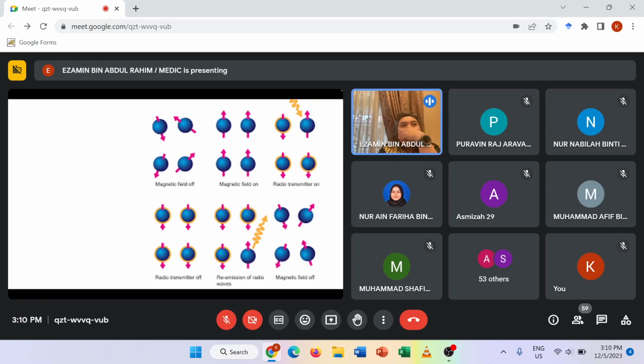The RF, if you notice, in the MRI you hear a "tet" sound. Have you been to our radiology department? Not yet? If you notice, the MRI machine is quite noisy compared with the rest. There is a tet, then a gap, then a tet and then a gap. Most of the time the tet is the radio frequency transmitted to the patient. It just sounds a bit noisy.